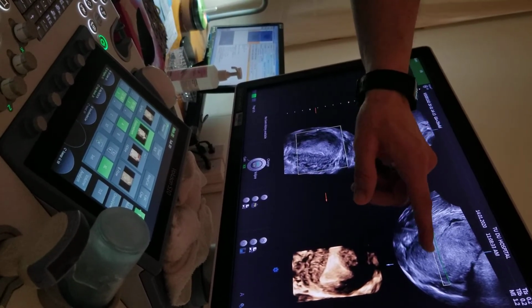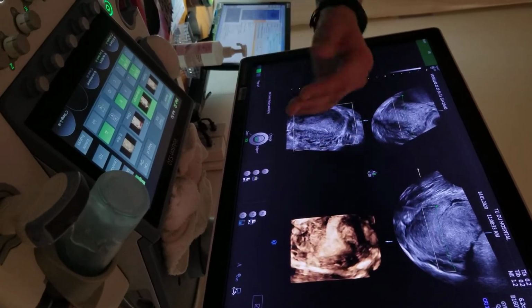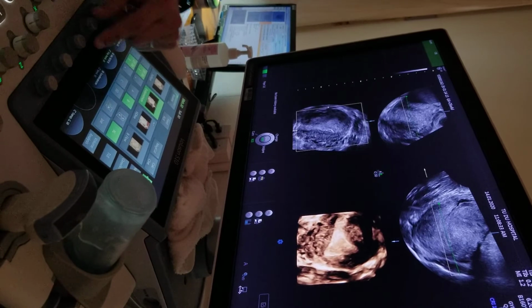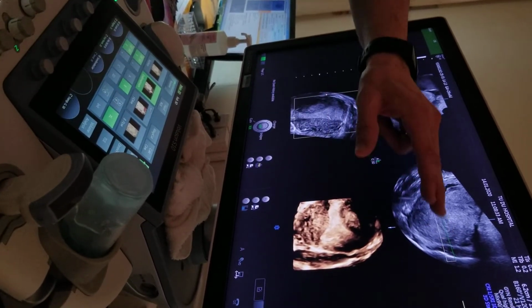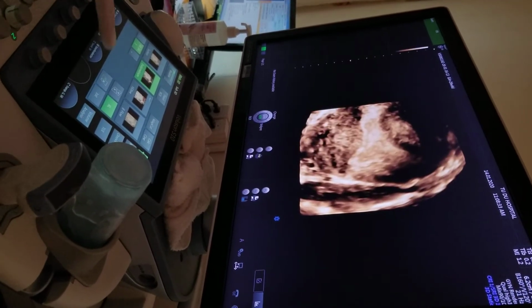Now we go to B. Make it wider, because you see how we cut the uterus here? But keep it small, tiny. And maybe we need to do a little bit of rotation on B with the Z, just a little bit. See how I brought this with me? Now you go to this one. You can do Z rotation.